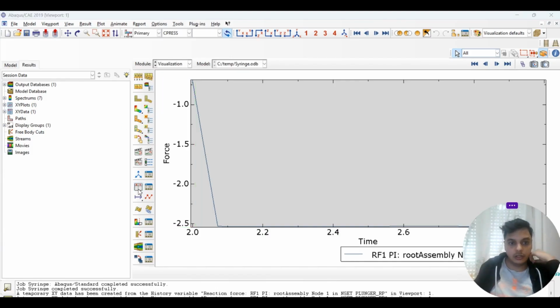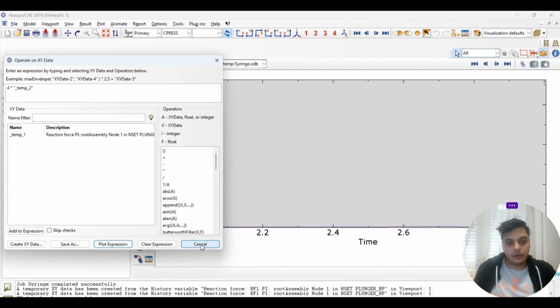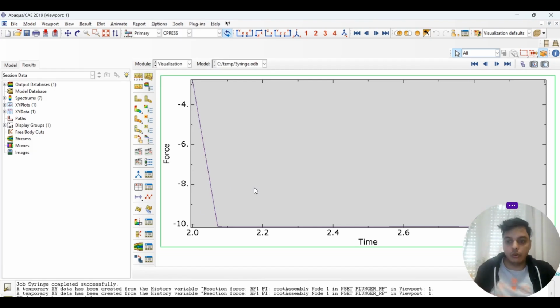We can do it in operate on XY data. So we can just use this data and multiply it 4 times for this particular operation, and we can also plot the expression. So whatever we get here is for the whole syringe, the contact pressure and the reaction force is what we have to define.